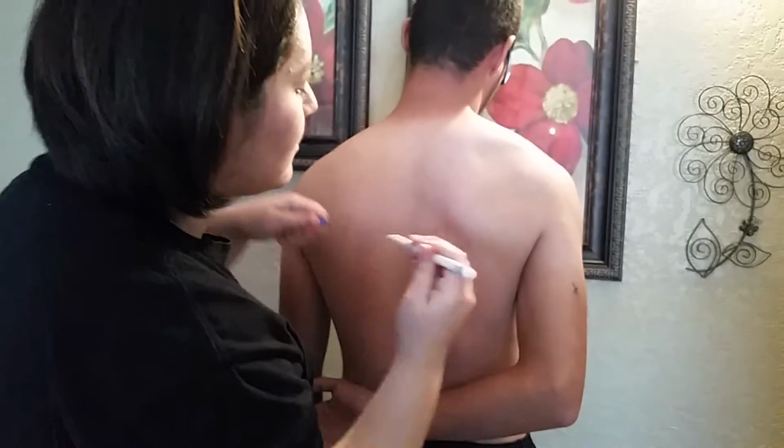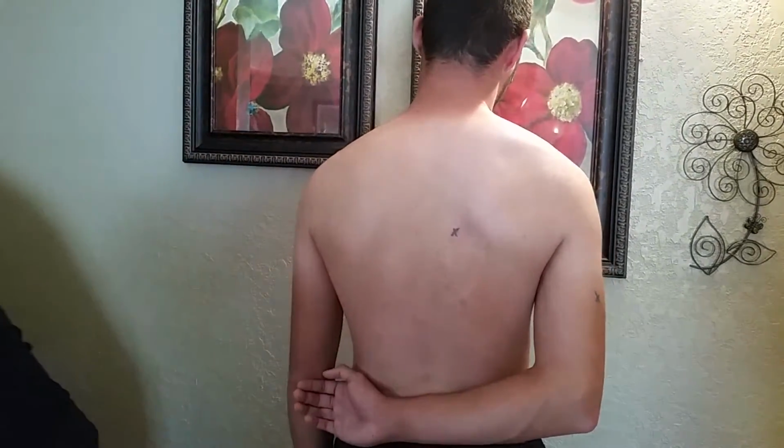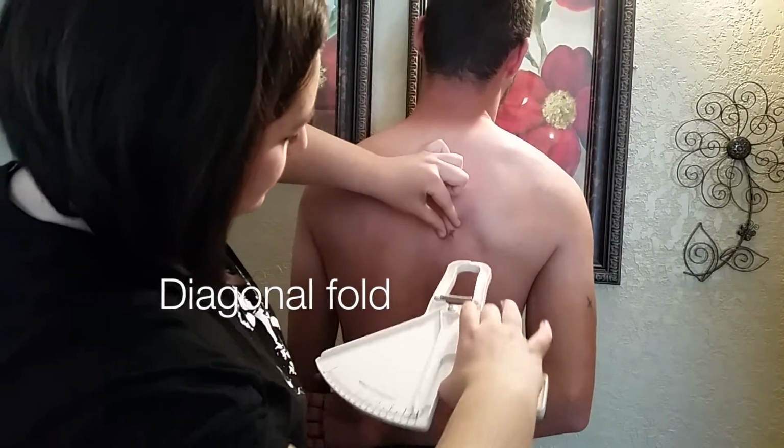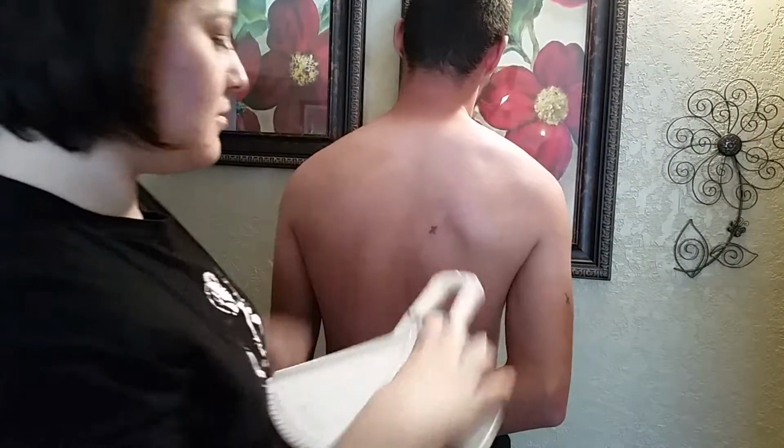For the subscapular site, have your client put their arm behind their back. Mark your X 1 to 2 centimeters below the inferior angle of the scapula. Perform a diagonal fold, hold for 1 to 2 seconds, and release.